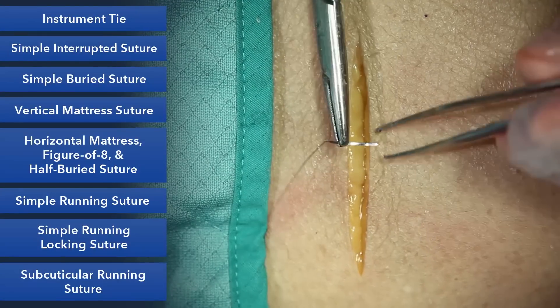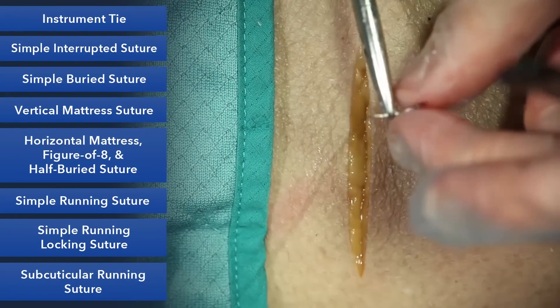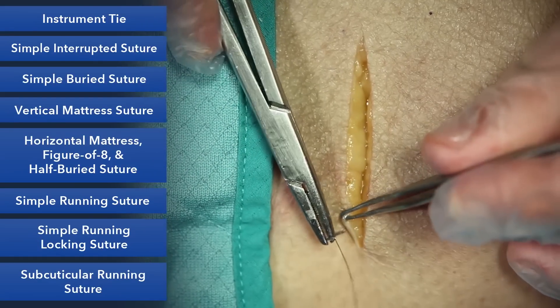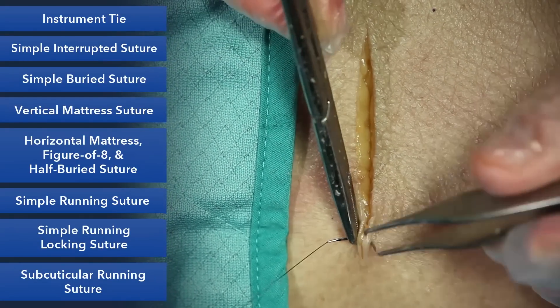Our next stitch is a simple running suture. This will be the most common suture you'll use to close incisions. It's a simple suture. So again, 90 degrees and 90 degrees, same bites on both sides.